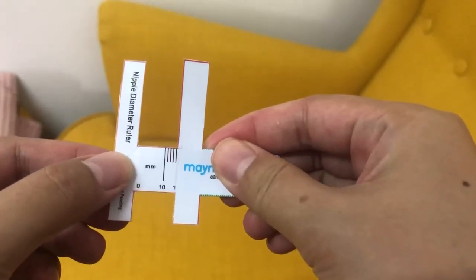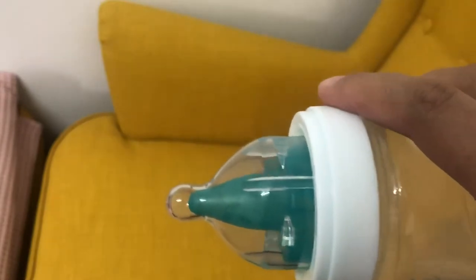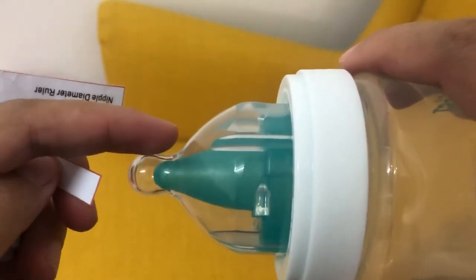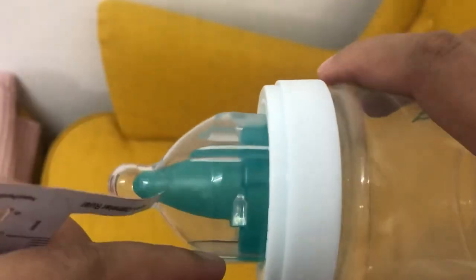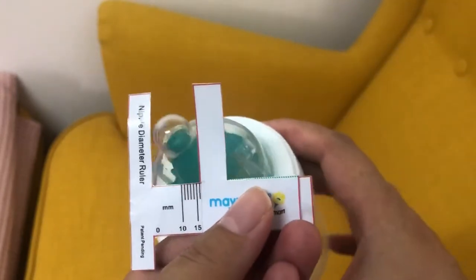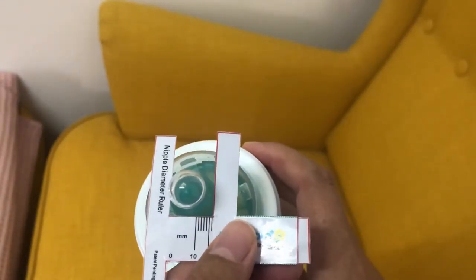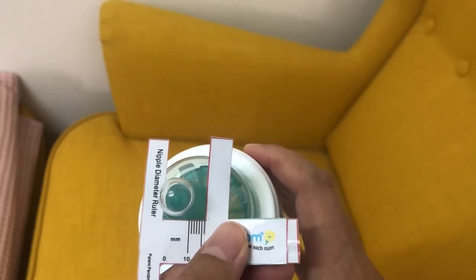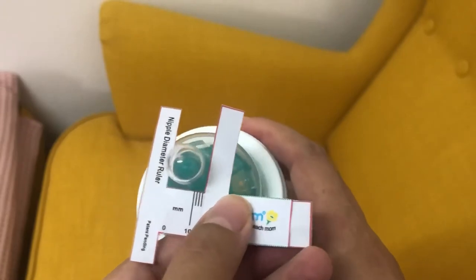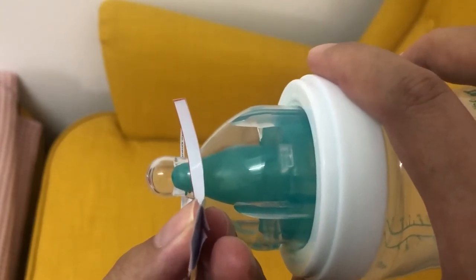I'm going to demonstrate how to use this by using a bottle — because a bottle is basically an artificial nipple and breast. So imagine this is your nipple and this is your areola and your breast. What you need to do with the nipple ruler is insert your nipple in between the nipple ruler and actually measure it. You should get to the diameter of your nipple just above your areola to know your nipple size.